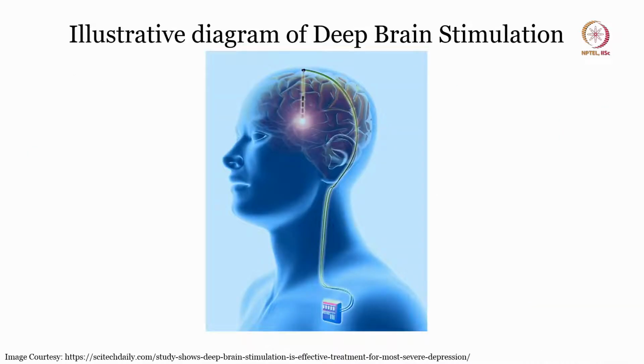If you see the next slide, how the deep brain stimulation is done. If you look at this part, this is, let us say, a pulse generator.